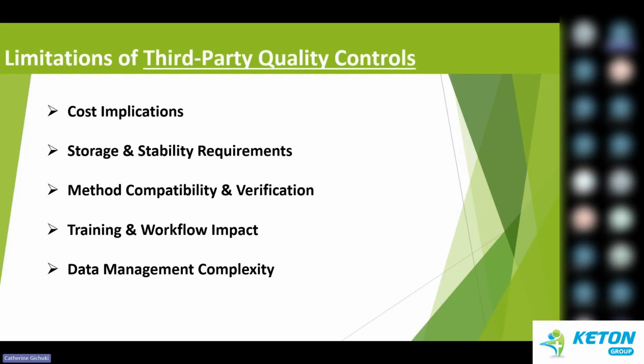Training and workflow impact, of course. When you're introducing third-party QCs, it's always required for you to train the staff on the new QC materials and rules. Most definitely, because once a machine is installed, there's that bit of training, running all the way from maintenance to QCs. And now, once you introduce a third party, you're introducing a new process or a new procedure. Then staff have to be trained on the new QC materials and rules.